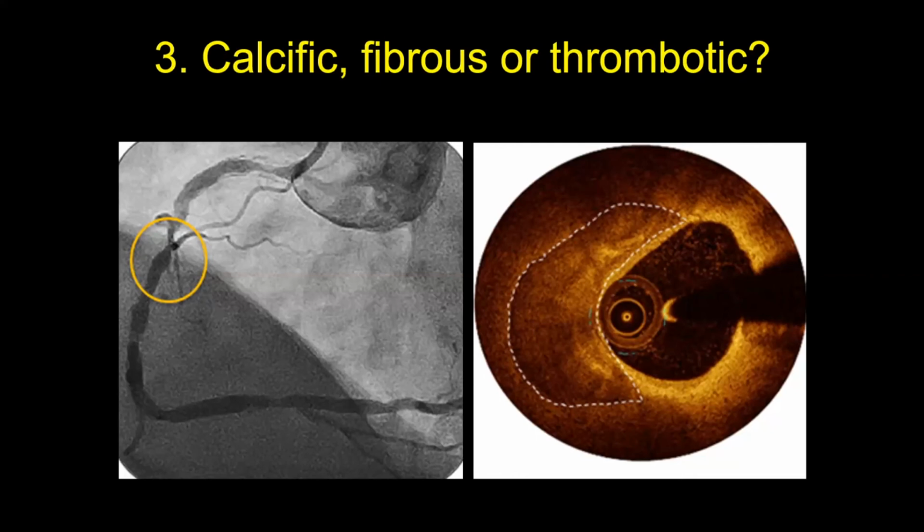Well done, Sohail. Yes, there are some markers. You can see even in the proximal part of that RCA that either there is a stent or there is a calcified lesion. But you are right that you always have to take it with the history. Was it a stable presentation or an unstable presentation? It could be mixed. But with OCT, I think that makes interventionists even less likely to ask for history.